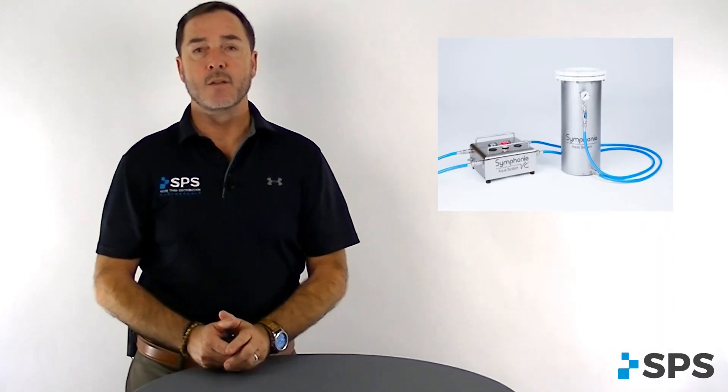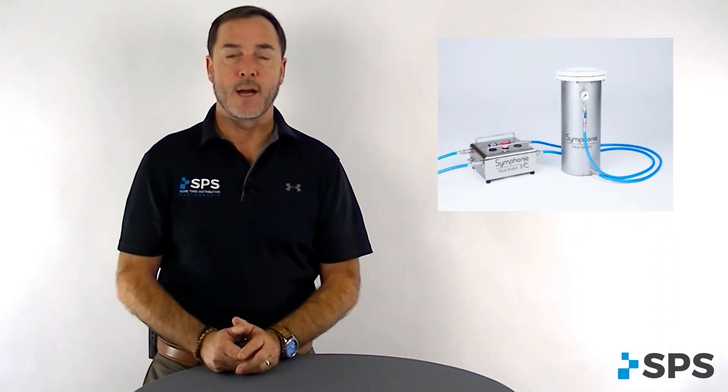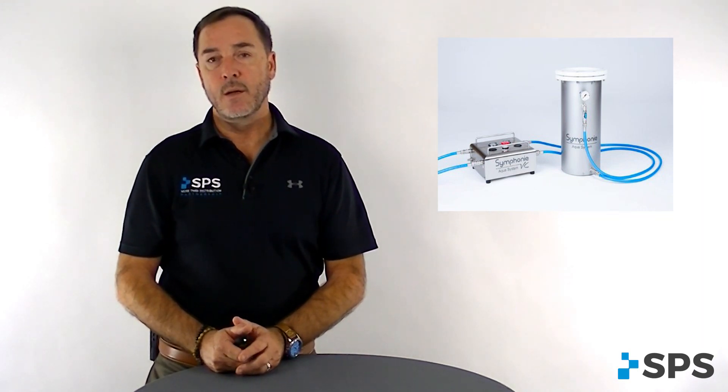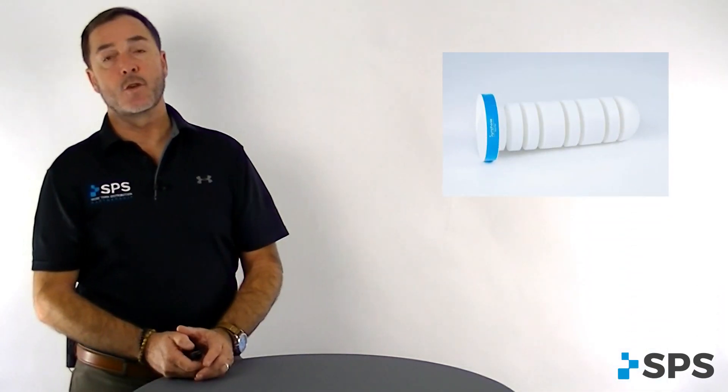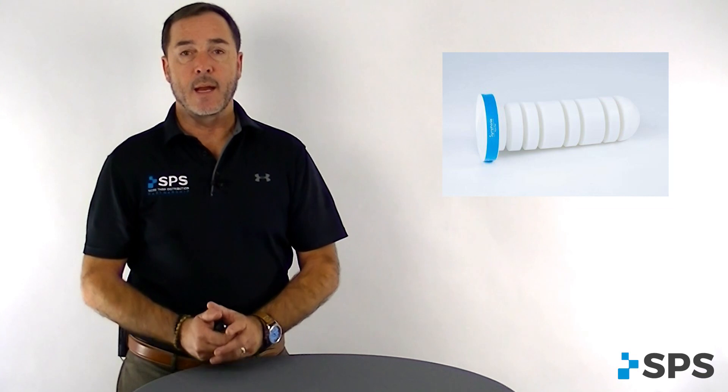The first thing that came out was the Symphony Passive System, or Vector Ready. This gives you the tank and a water bag that you can fill the system up. This can be used for remote fittings or travel. Next system to come out was the Symphony Aqua System Vector Control System. This allows you to control the weight bearing characteristics, loading more soft tissue or less depending on the amount of water added or subtracted from the tank. You utilize the vector control tower inside the tank with that and get ready.